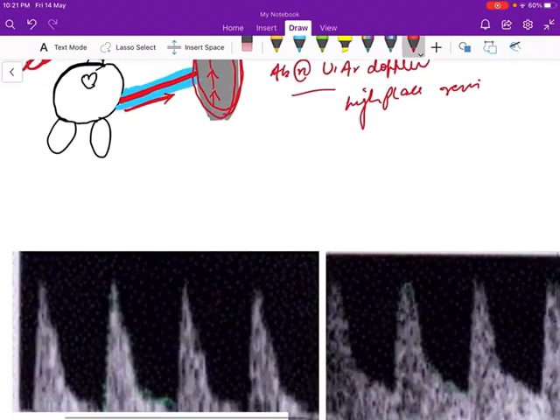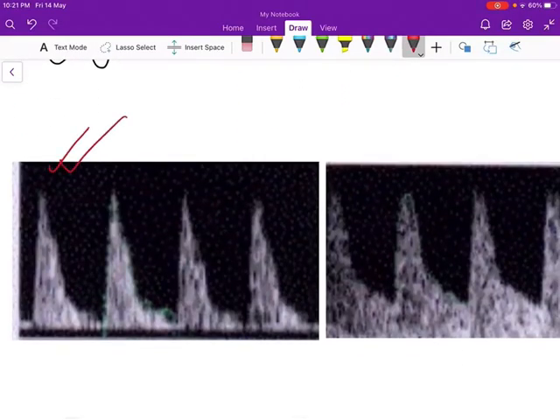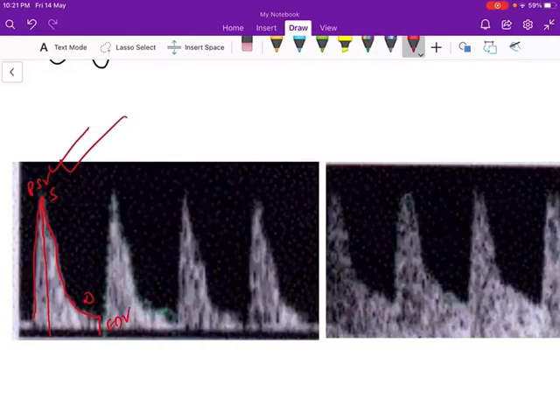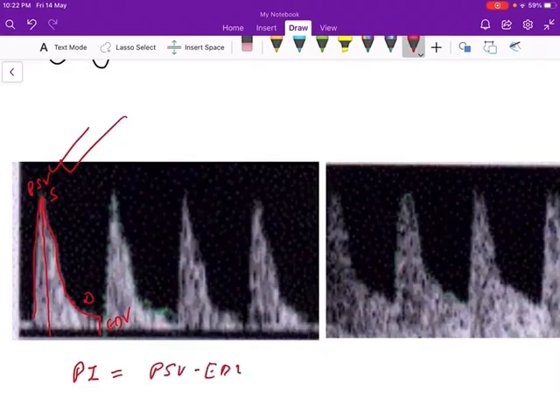This is the normal MCA Doppler pattern. This is the systolic flow and this is the diastolic flow. The peak is the peak systolic velocity (PSV), and this is the end diastolic velocity (EDV). The question is asking about PI — pulsatility index. The formula is: Pulsatility Index = (PSV minus EDV) divided by time-averaged velocity.